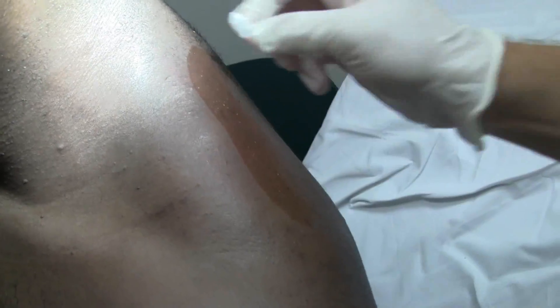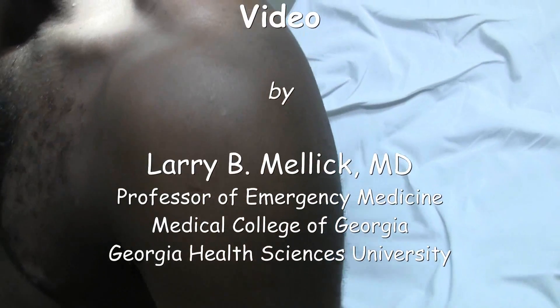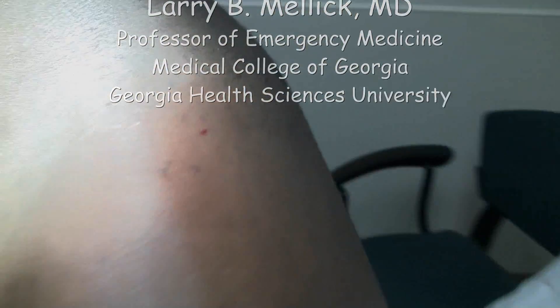But we're injecting bupivacaine 0.5% and a total of about 40 milligrams of Solu-Medrol. So what would you say your pain is doing now, sir? It's lightened up a little bit. Move your arm around, let's see if it works. Feels a lot better. A whole lot better. Okay, good enough. Thank you so much, appreciate it.